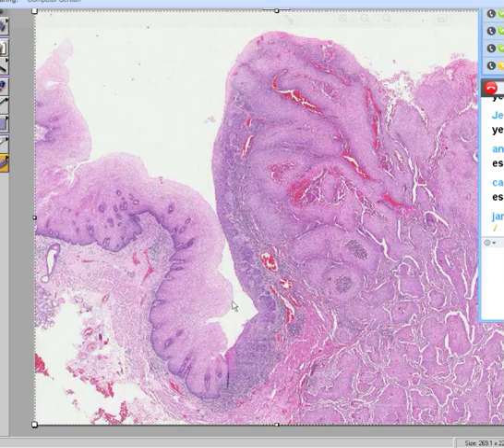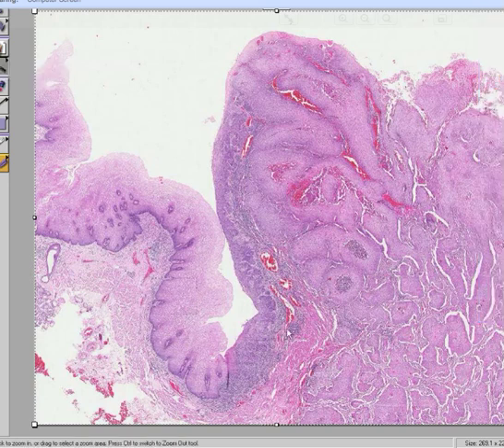And then on the right, it looks like there's some kind of massively dark change to that normal non-keratinized squamous mucosa where it looks darker. And it also looks like it's pushing stuff into the wall. So even if we don't blow it up, I think you probably have a pretty good idea what the diagnosis is already. And if there's a wise guy out there that wants to say carcinoma, like Margaret, then you're right. But let's look at it in a little bit higher power too.